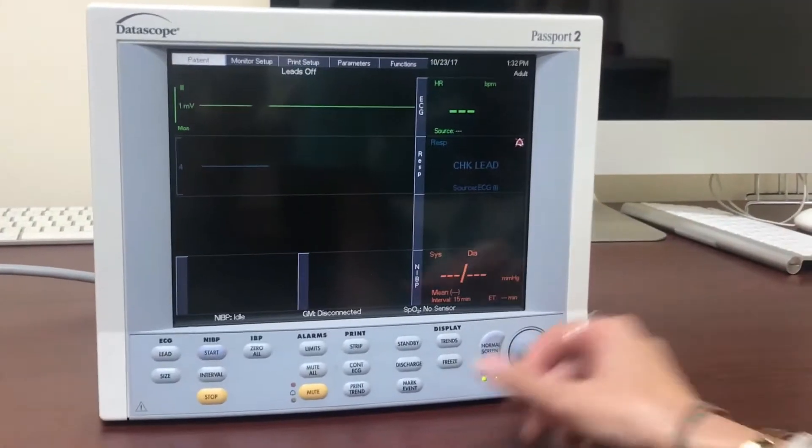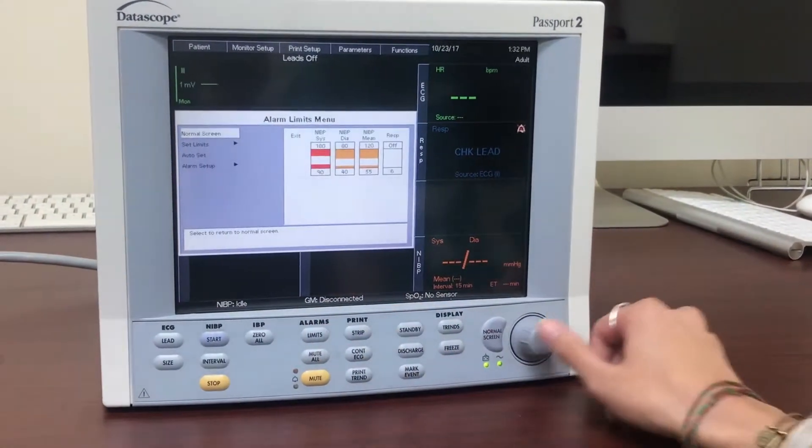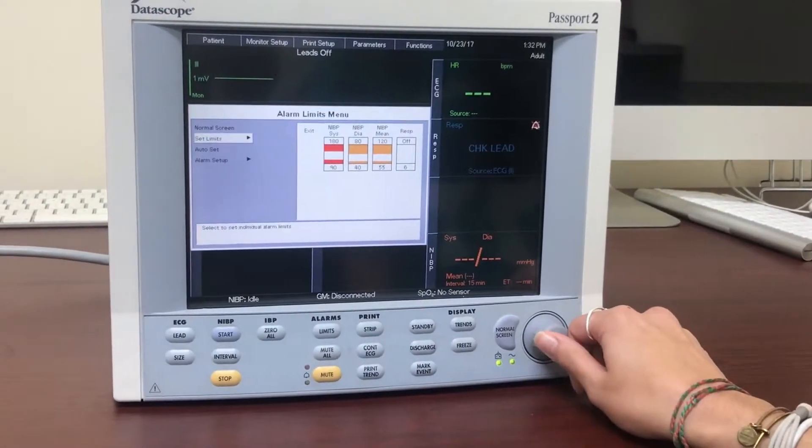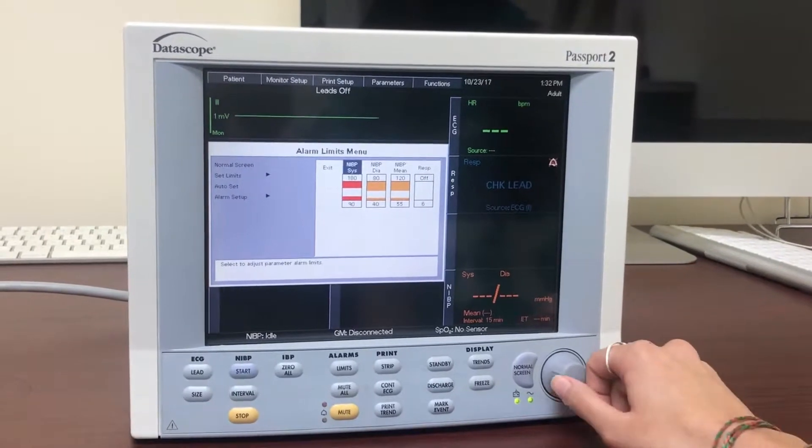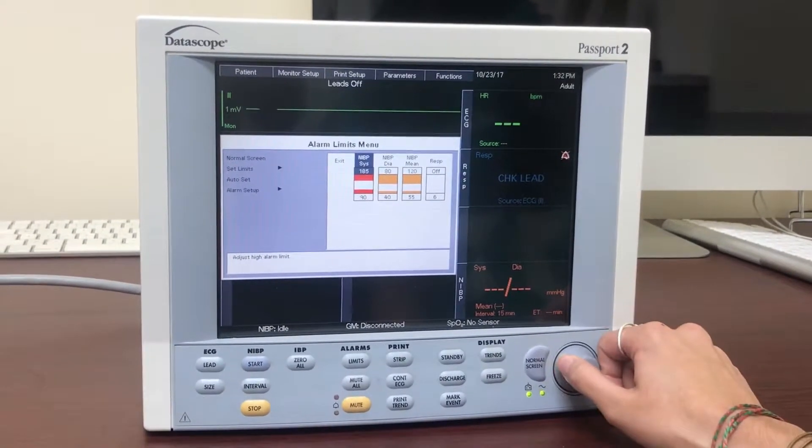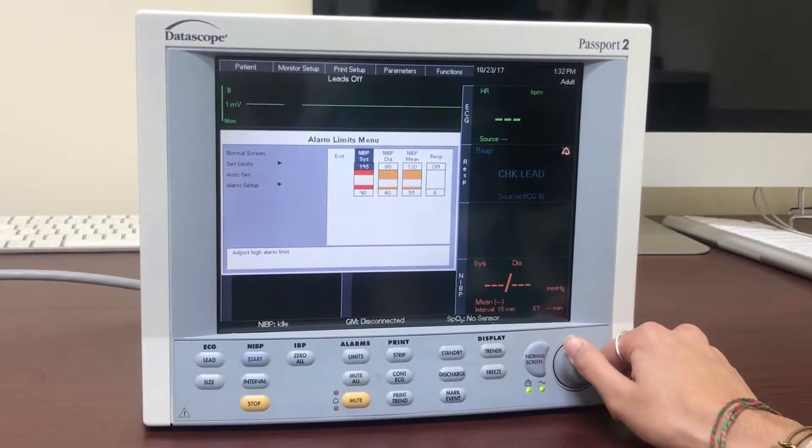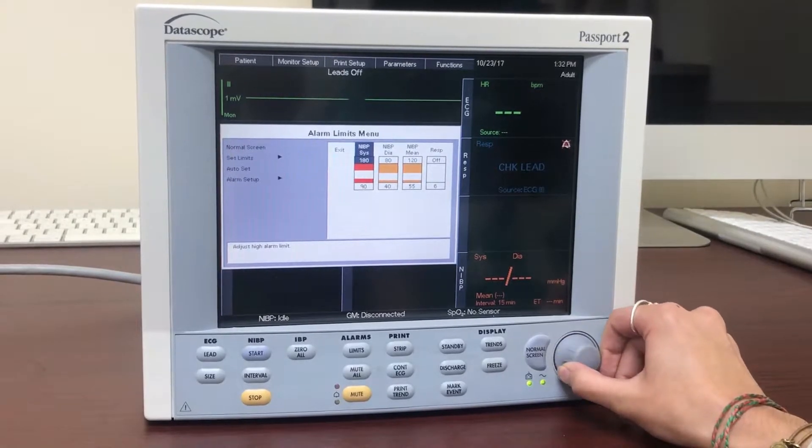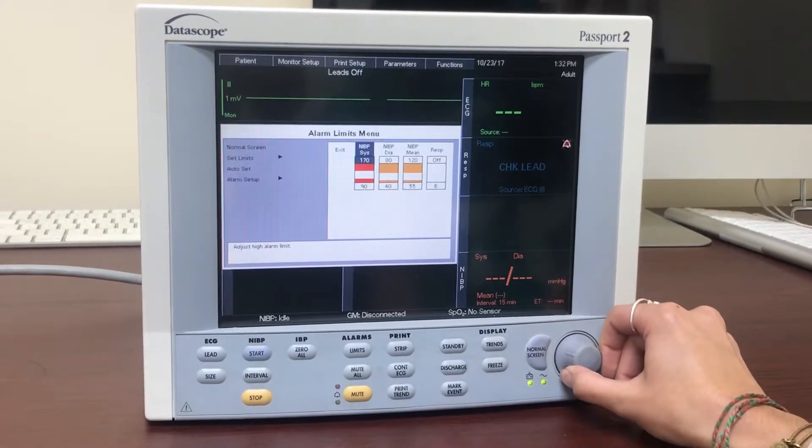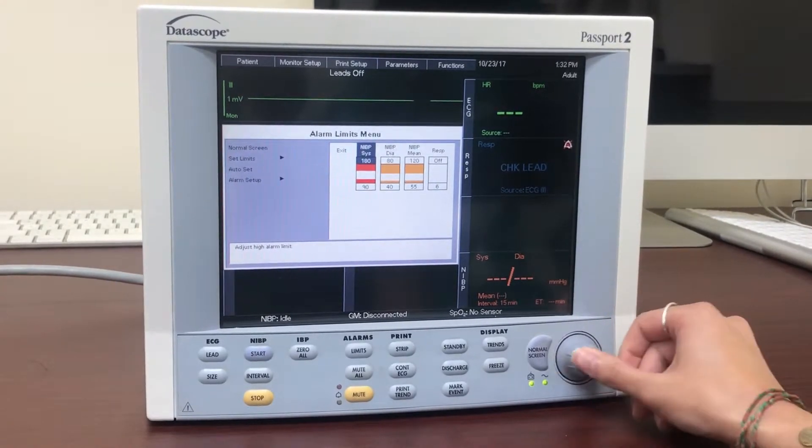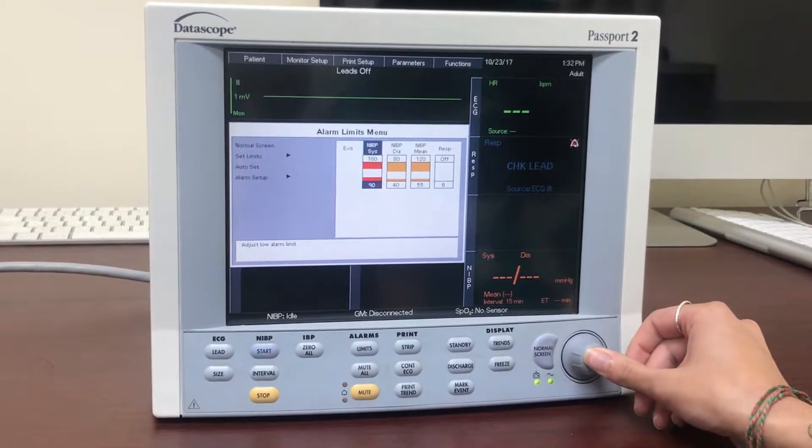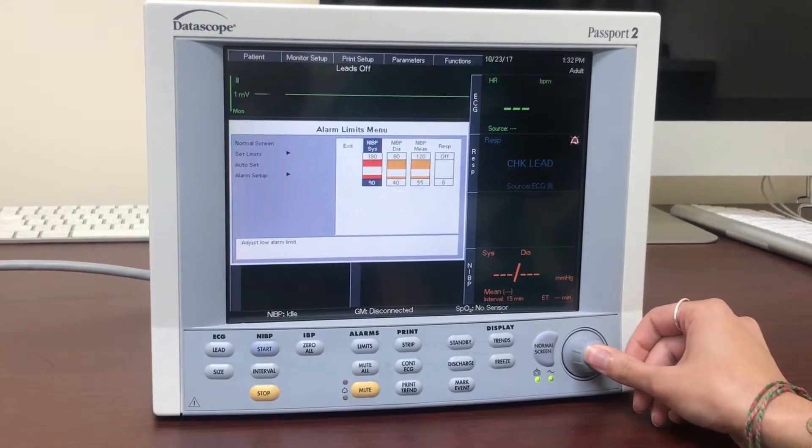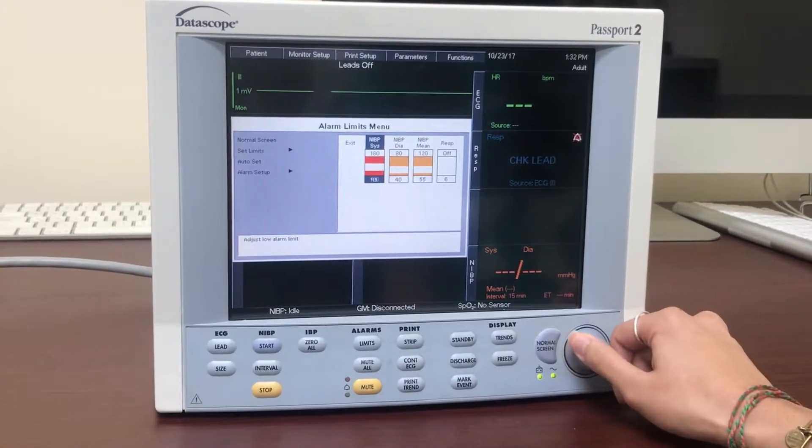First, press on the limits button found under the alarms column on the front screen panel which will take us to the alarm limits menu. In order to change acceptable range of systolic, diastolic, or mean NIBP, or your SpO2 sensor respiratory values, click set limits and click on the corresponding range you wish to change.